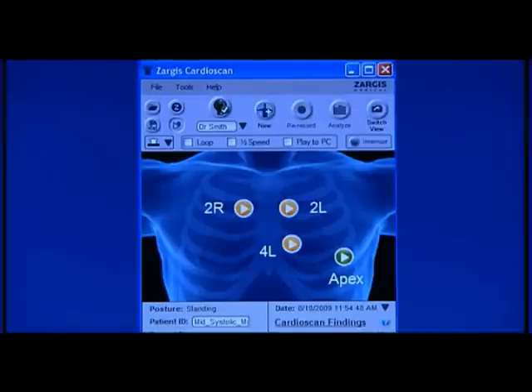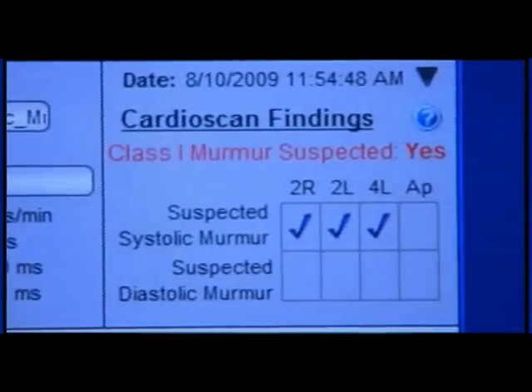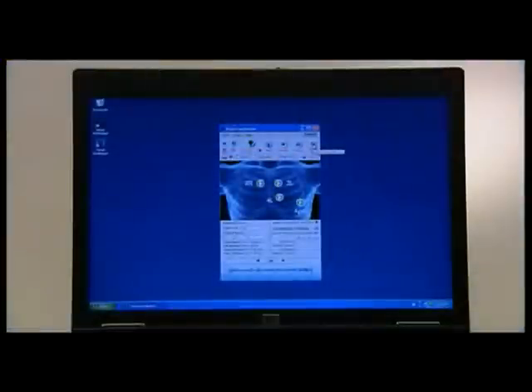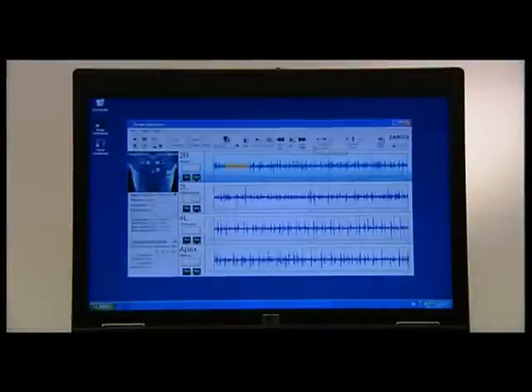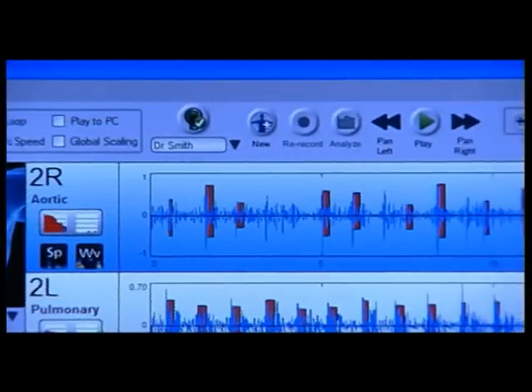There are two main screens of the Zargis CardioScan software. The smaller screen appears by default and is meant to provide a summary of all the key information a clinician needs to make a diagnosis. However, there is also a larger, more detailed screen that provides additional information to support a clinician's diagnosis. You can listen to the recording for a site by clicking on the play icon within the corresponding circle. By default, the recordings are played back through the ear tips of the Littmann Model 3200 stethoscope.